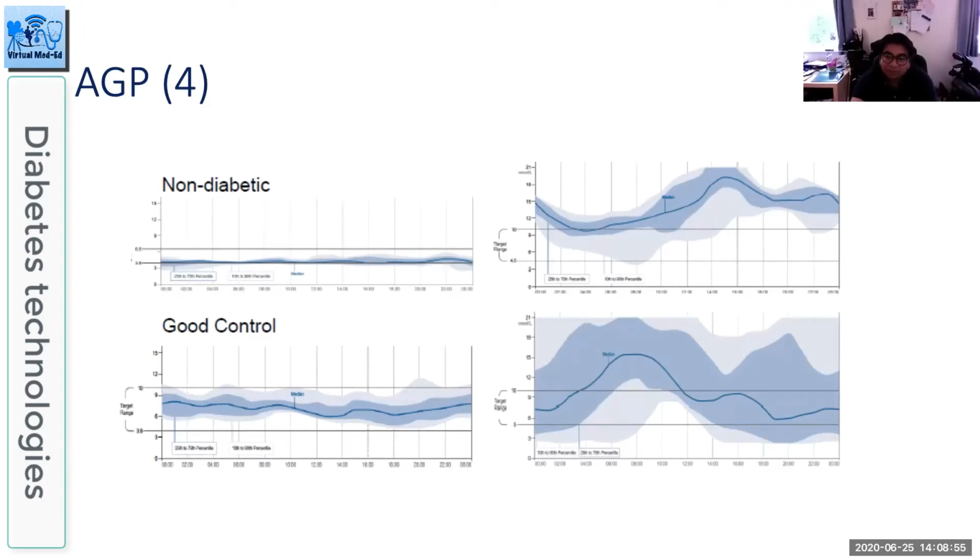And then on the right side, both the graphs, particularly on the top one, you can see the sugars are high, the time above range is very high, but saying that the variability is very narrow, making it more predictable. Any changes that you're going to make will give you some element of safety netting basically for the patient. So it's much easier to influence change both from the HCP point of view and patient point of view if the variability is narrow, because it's more predictable.